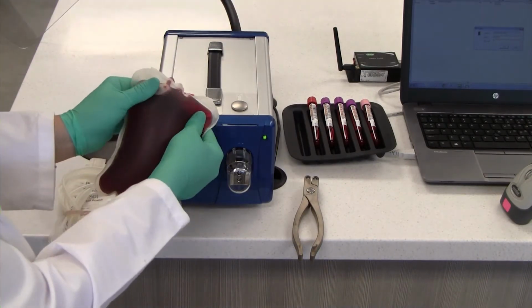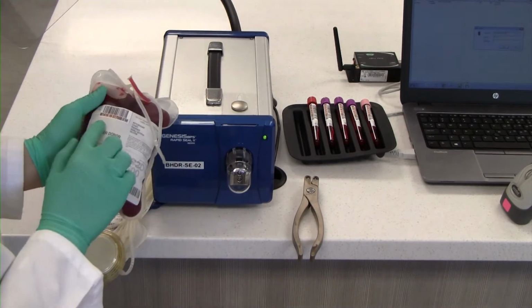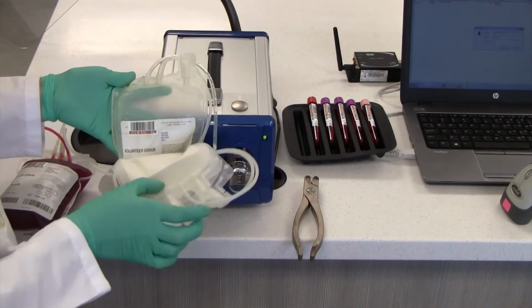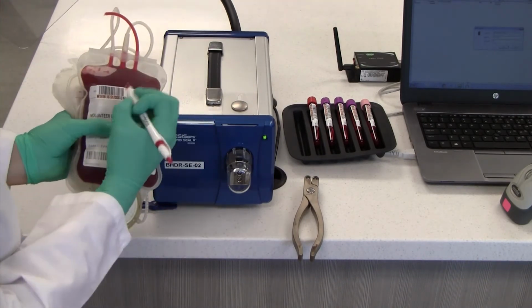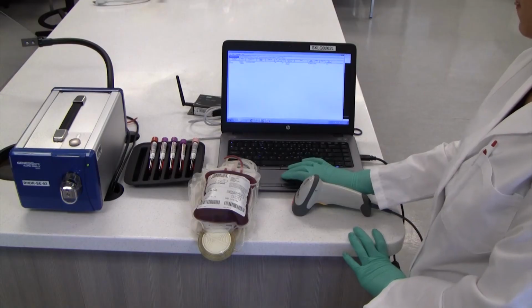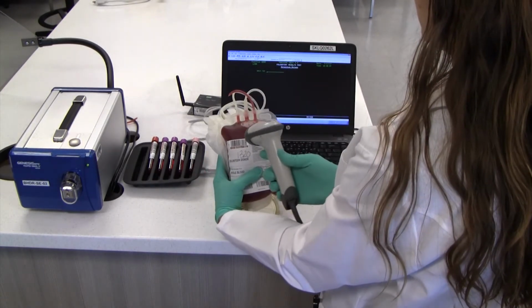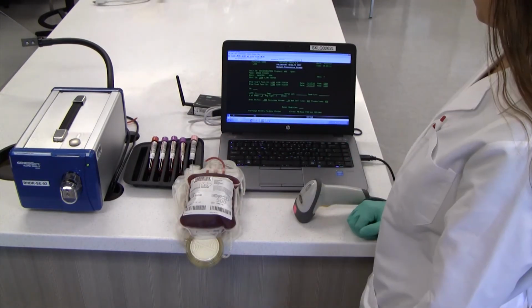Inspect the component. Verify the satellite bags have documented blood type, sex, prep time. Write inspection time on the collection bag. Access BBCS function 090. Scan the DIN label on the collection bag. Press F22 to populate phlebotomy results.